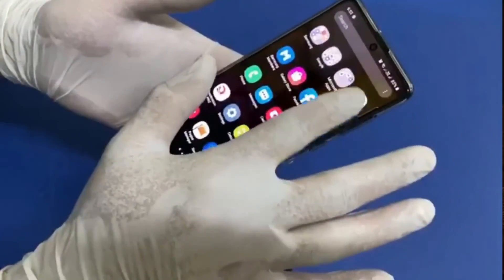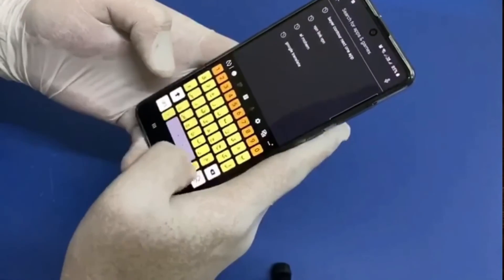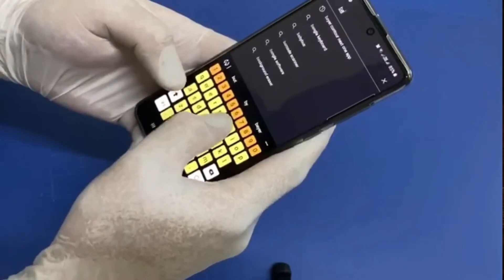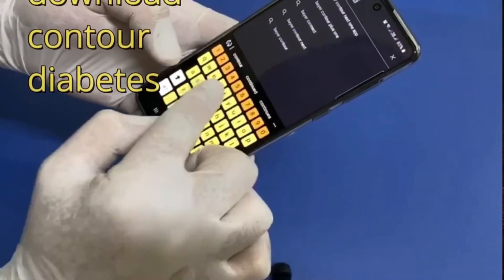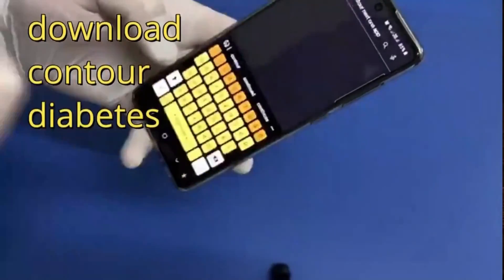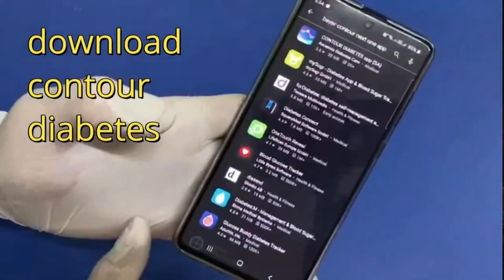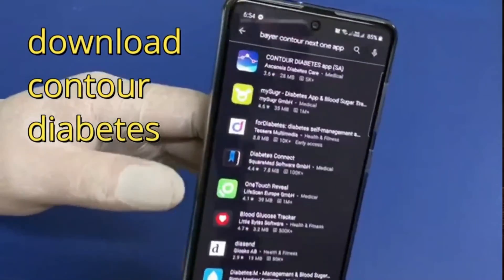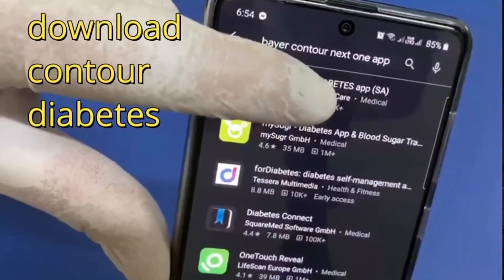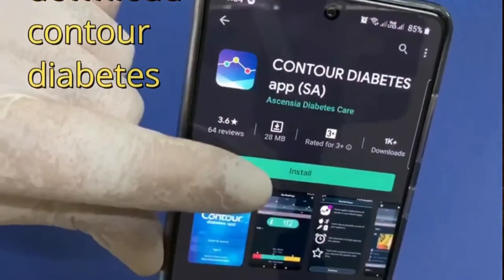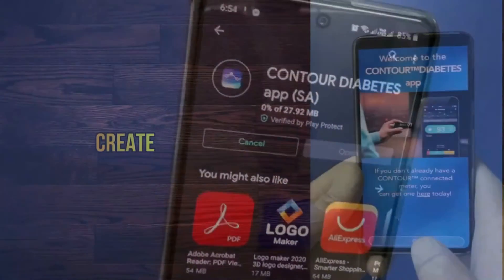First, go to the Play Store and download an application for the Contour. I will show you the name of the app — download the Contour Diabetes app. You can see here — download with this name exactly: Contour Diabetes app, and install it.